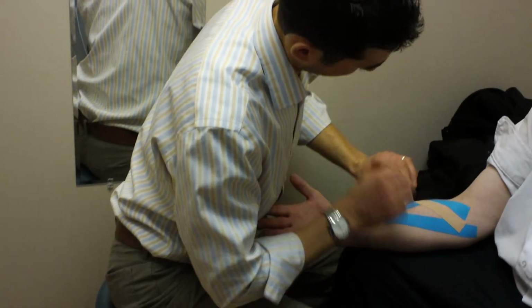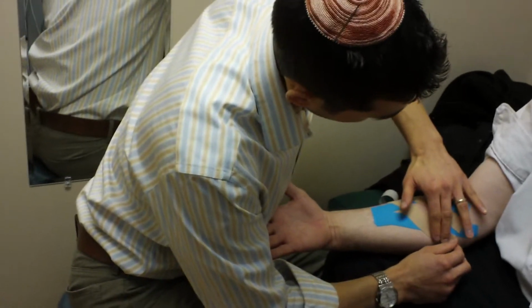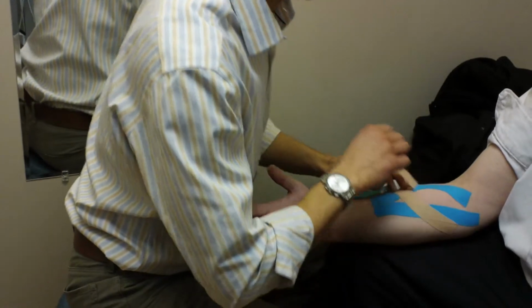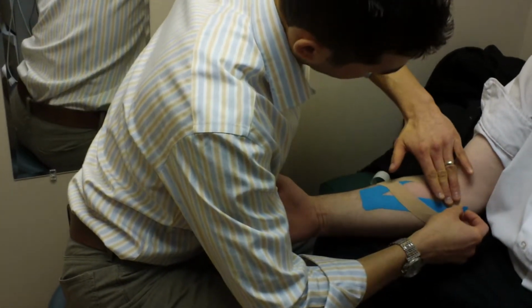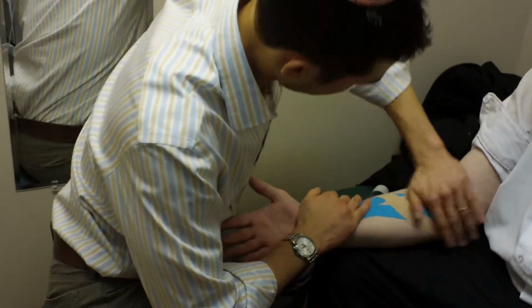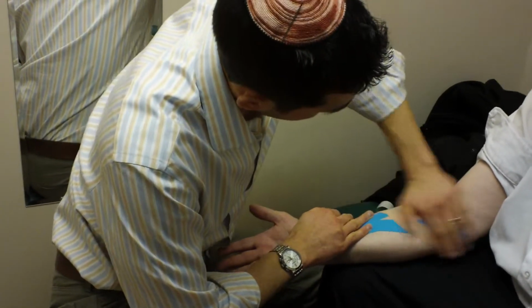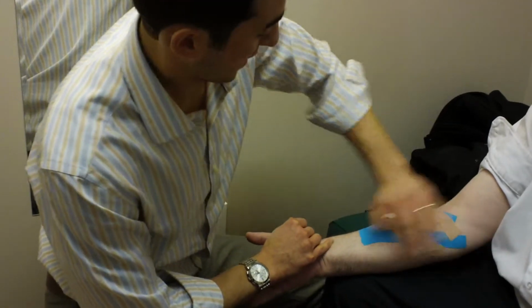And now again, I want to take just a very slow, almost no tension at all, 0 to 15%, working our way up to the origin of the muscle. Same thing on this side. And by rubbing down the tape, we're able to activate the glue so that it makes sure that it doesn't come off.